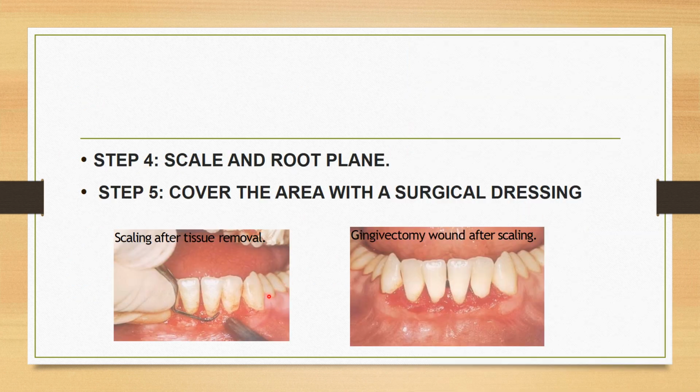Then, after examining the area, you can do scaling and root planing, and prepare the tooth surface, and cover the area with the surgical dressing. So there is the gingivectomy. This is the case: there is a gingivectomy wound after scaling.